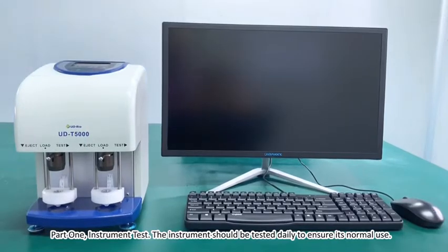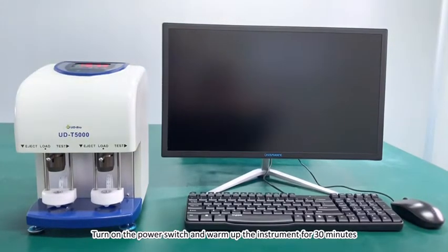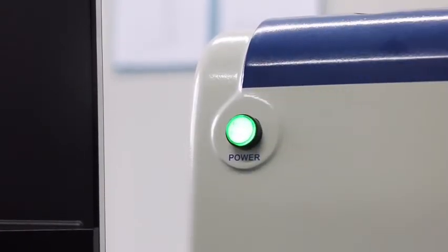Part 1: Instrument Test. The instrument should be tested daily to ensure its normal use. Turn on the power switch and warm up the instrument for 30 minutes.